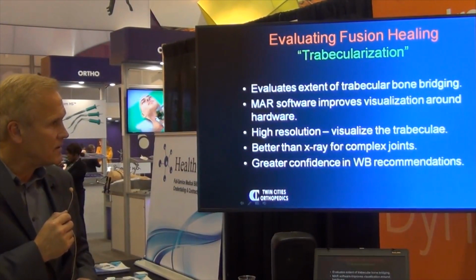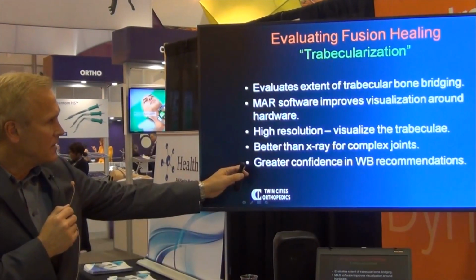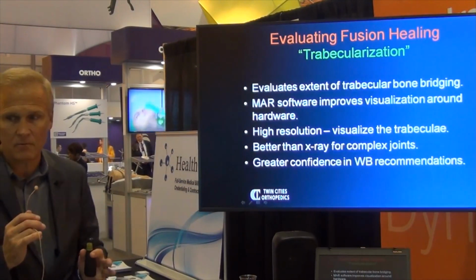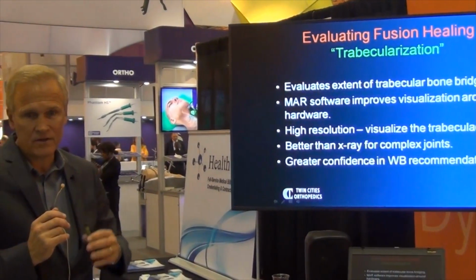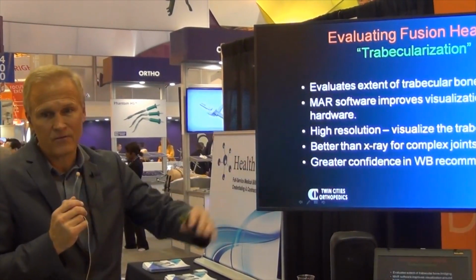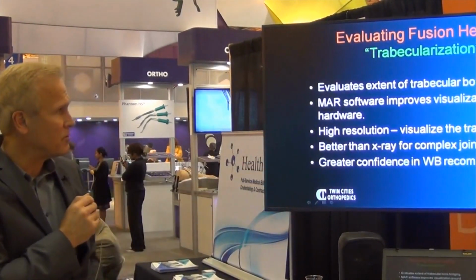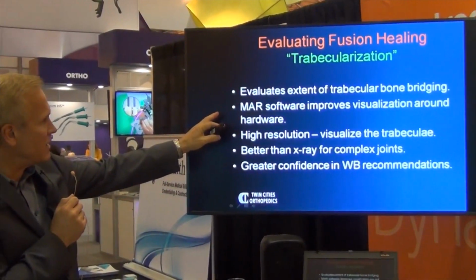We want to make sure that we can report the benefit of these things, especially when new technologies come out. And for reporting this, the journals now, especially Foot and Ankle International, are really pushing us to get more CT scans after surgery to prove that these fusions are really solid. Plain X-ray is notorious for midfoot and hindfoot not being very accurate as to whether or not there really is a fusion there. So they evaluate the extent of trabecular bone bridging for all these studies that we're doing.